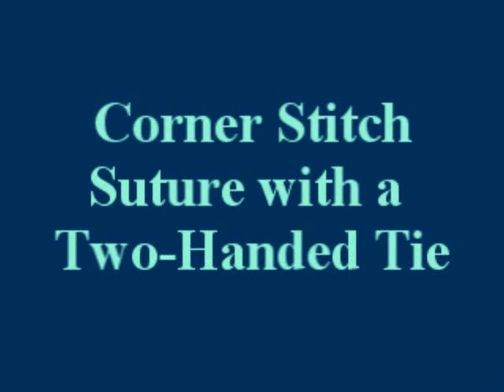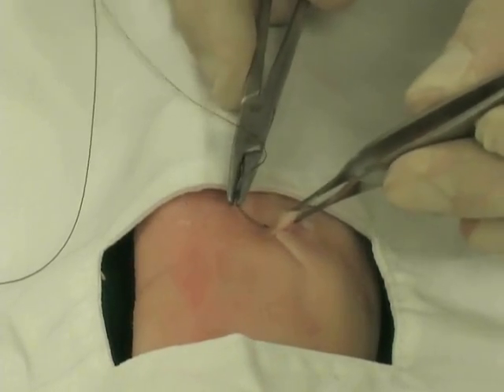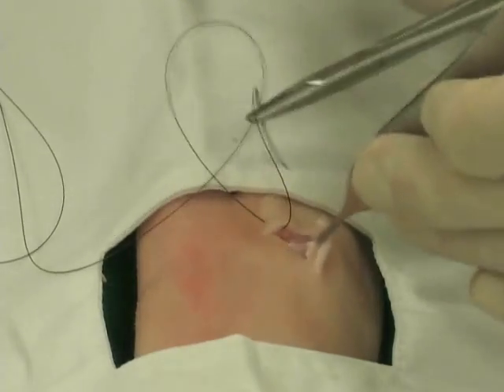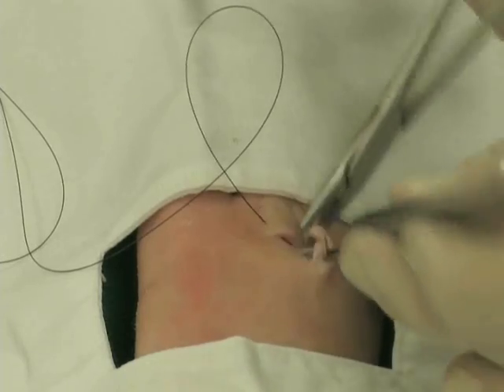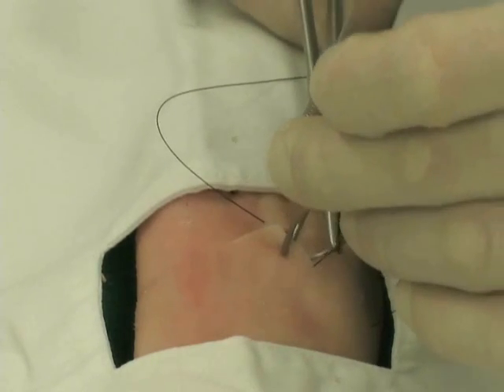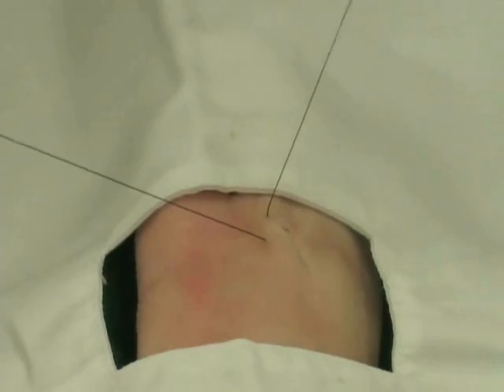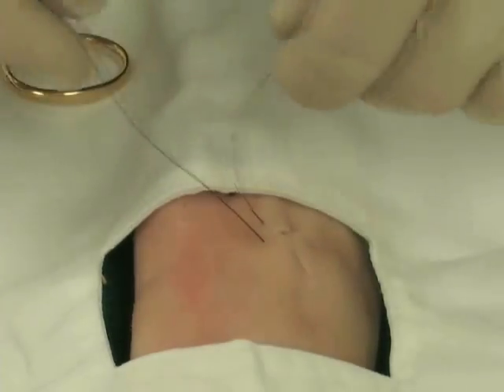Now we will demonstrate a corner stitch with a two-handed tie. With a corner stitch, imagine a plumb line through the middle of a flap. The first suture starts above the apex and is parallel to the plumb line. Then lift the flap and from one side of the plumb line to the other, place the subcutaneous suture. Finally, in the other direction, place another suture parallel to the plumb line that comes out parallel to where the first suture went in. Hold the end of your suture as you pull through so you don't pull the string all the way through, and leave yourself a long enough tag for a two-handed tie.